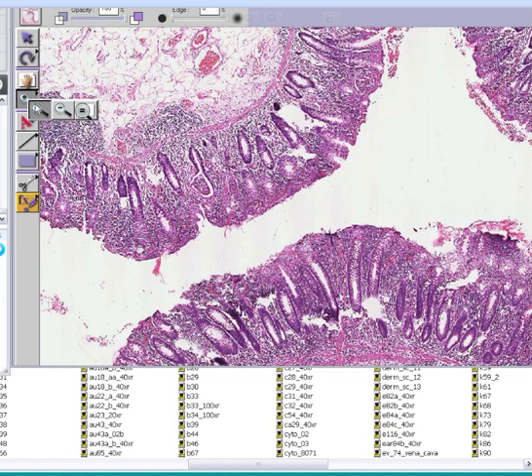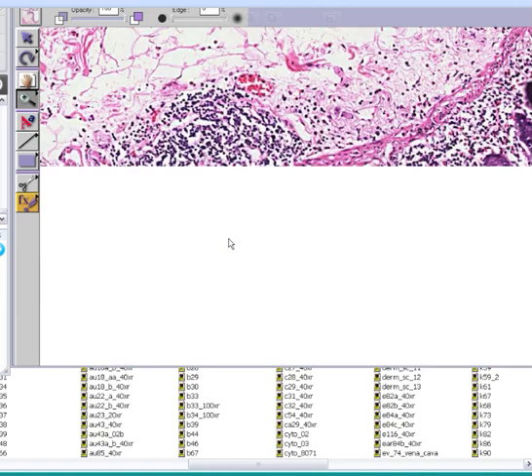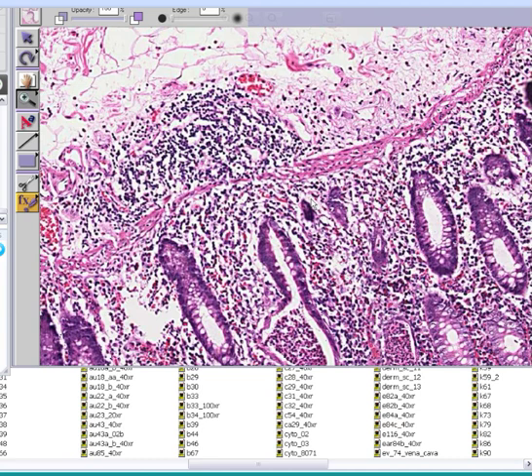And what I'm going to do is blow this up now even more. I remember the lag time. It's going to take about 10 seconds. I think everybody sees it. I'm not going too fast. Okay, tell me when you can see the blow-up view, Jim. That should be in a few seconds.